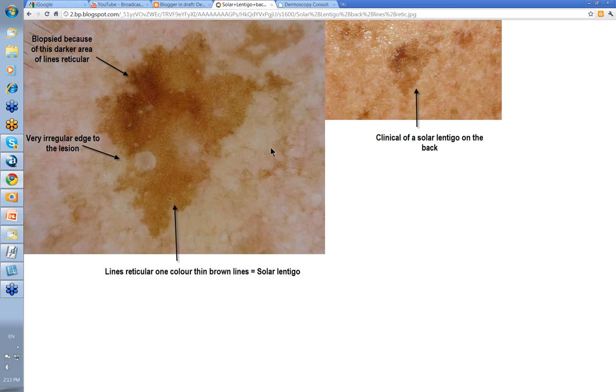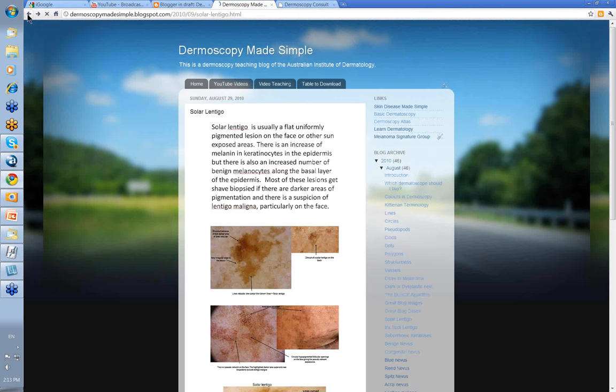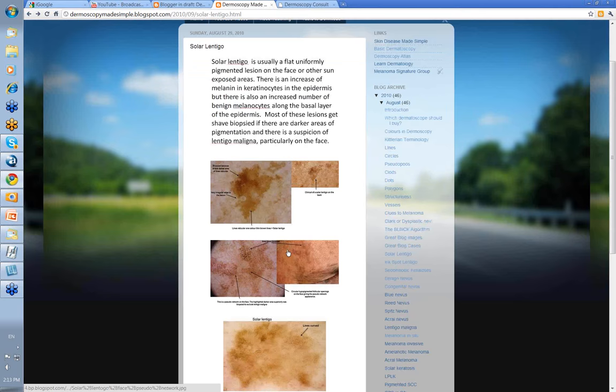On the back, a bit of variation like this is not uncommon. One color, one pattern — benign.